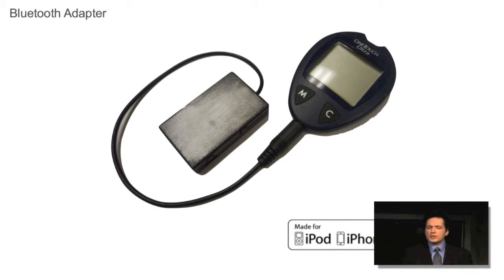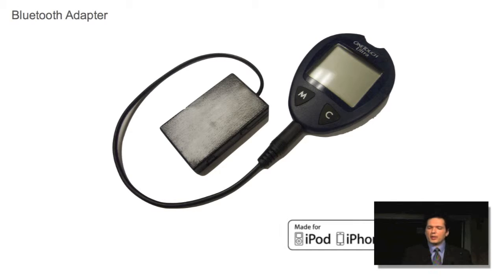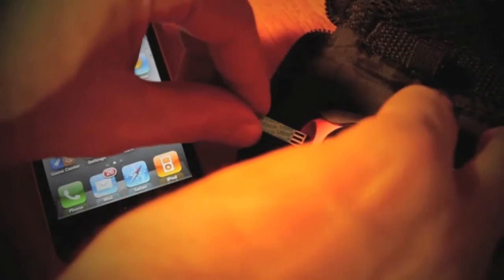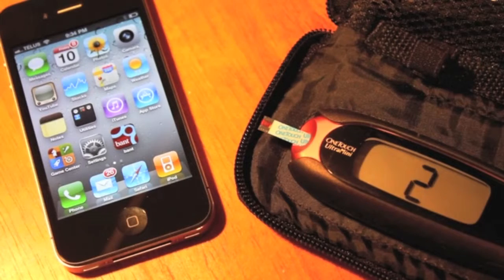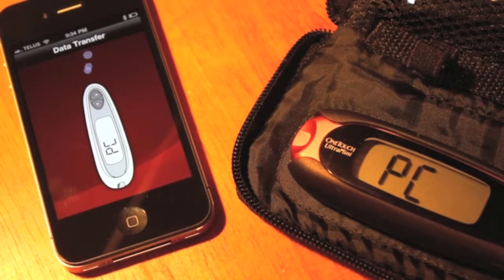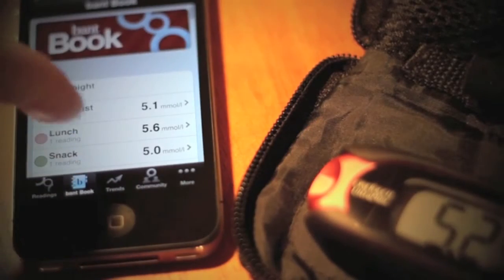So we had a wired version and a wireless version, and we ended up going with this modified one. Again, this is technology that we developed to get the data out of the glucometer and over onto the iPod, iPhone, or iPad. And this is what it looks like. So again, this is the first example of a medical device communicating with an iPhone. A huge roadblock, much simpler to do on the BlackBerry, I might add, but Apple, in the end, was very responsive, and we were able to do this. So this communicates over Bluetooth, and you can see that once they pull the strip, it will evoke the Bluetooth signal, automatically turn the Bluetooth on, BANT will launch automatically, and the data transfers. So it's all there, and the community and so on.